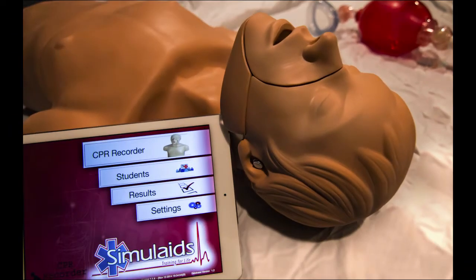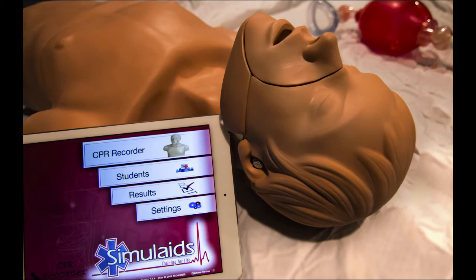Simulaids CPR recorder with iPad control. It's that easy.